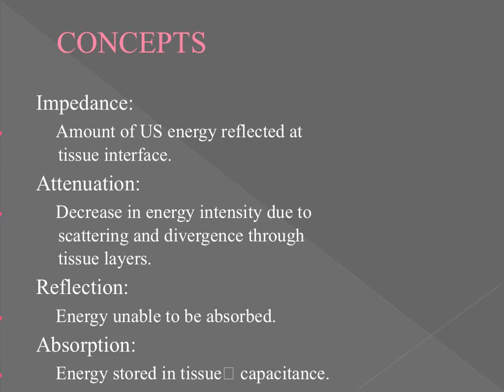So then we have attenuation, which essentially is this decrease in energy intensity or signal strength, for lack of better words, or ultrasonic energy, which typically happens as a result of scattering of the ultrasonic energy or divergence of the ultrasonic energy through the tissues.